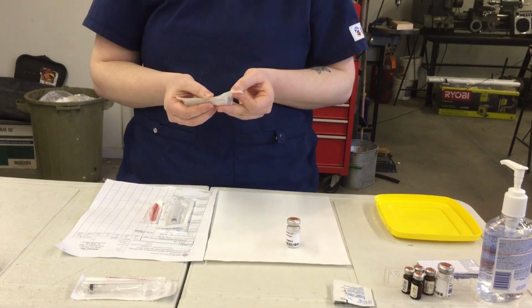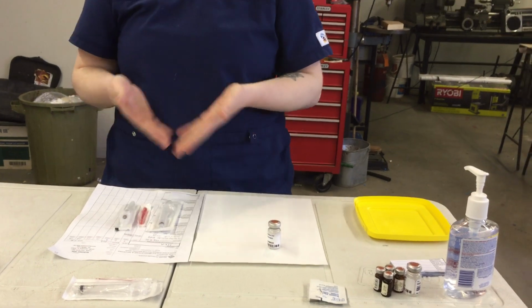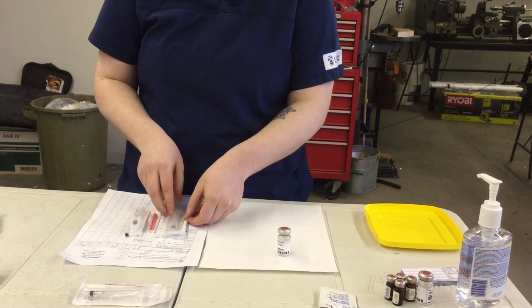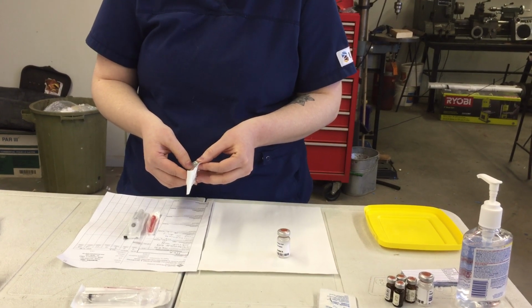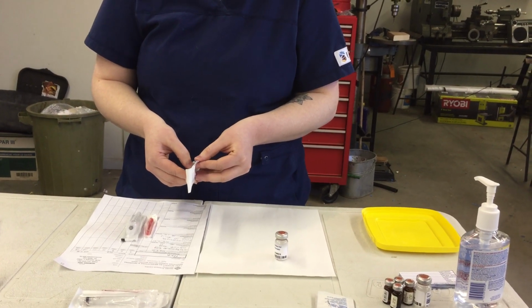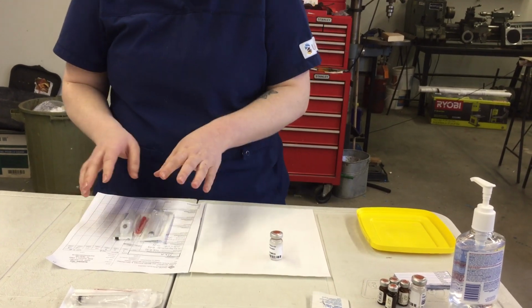So after I've established that this is the correct needle, I would normally check to make sure the integrity of this packaging was good, but obviously for demo reasons, I've reused these. Also, I'm just going to note that the side of my syringe here is rubbed off, so I'm going to try my best to show that I've gotten 3 mLs, but just note that it is rubbed off and not as well as it was at the beginning.